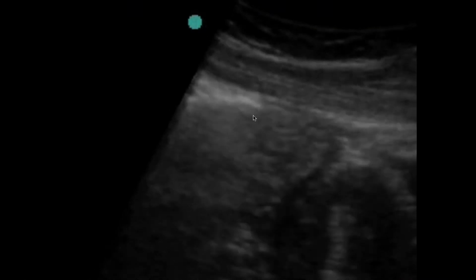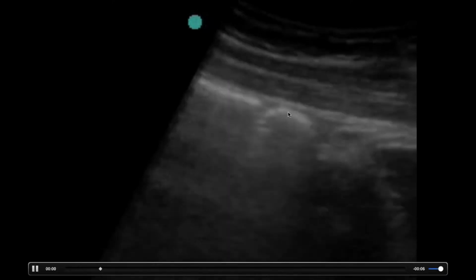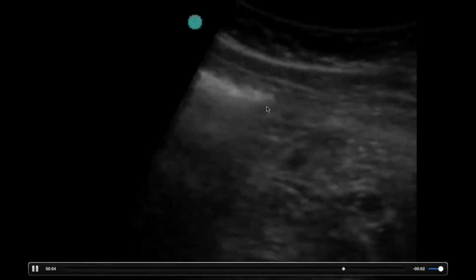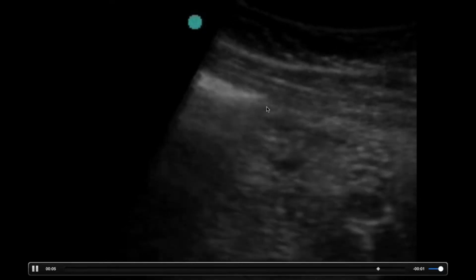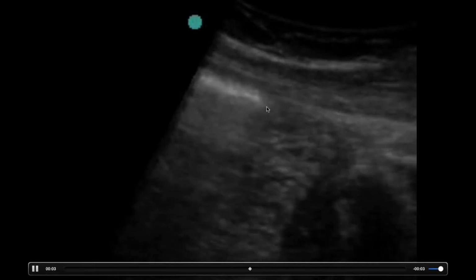Why is abdominal aorta scan so challenging? Well, oftentimes when you put the transducer on, you're going to see a bunch of gas. Okay, so patient bowel gas is definitely a concern. You'd want firm pressure, graded pressure on the patient, but that doesn't always solve the problems. And secondly, patient body habitus really does make examination quite challenging.